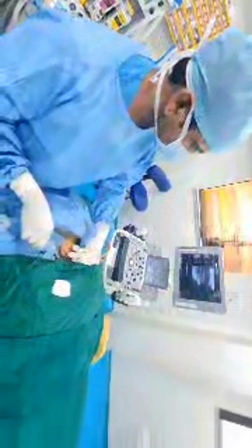Because of one nodule on the left side, why remove the entire thyroid? We can save the thyroid gland so that the patient will not need complete replacement therapy later on. That is why we only ablate, meaning only this nodule is treated.